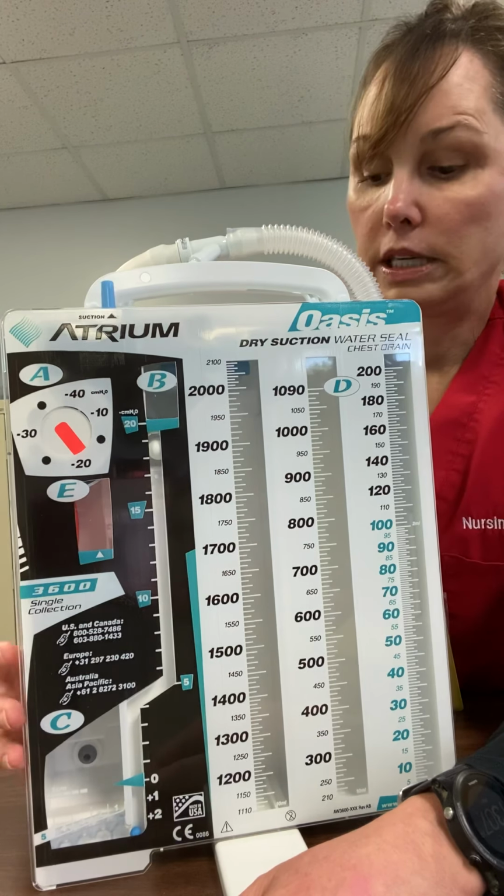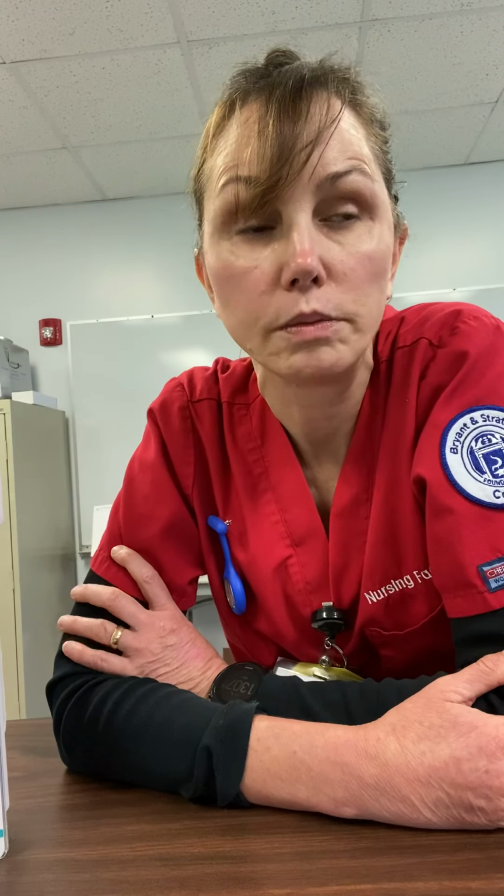So that's about it for chest tubes. Whether they're wet or dry, the nursing care is always going to be the same. Some of the things that you need to watch out for if your patient has a chest tube: number one, if their O2 sat goes low, you might call a rapid. If it's under 90, you might call a rapid.